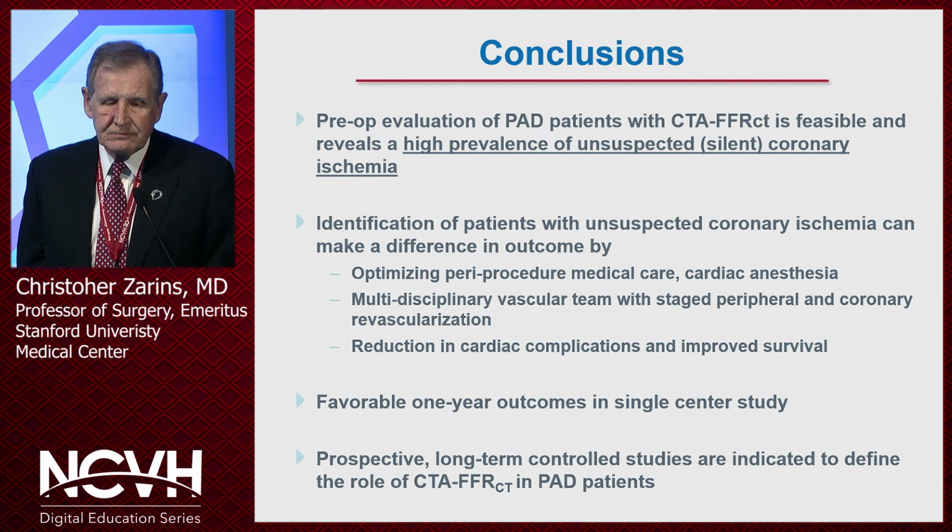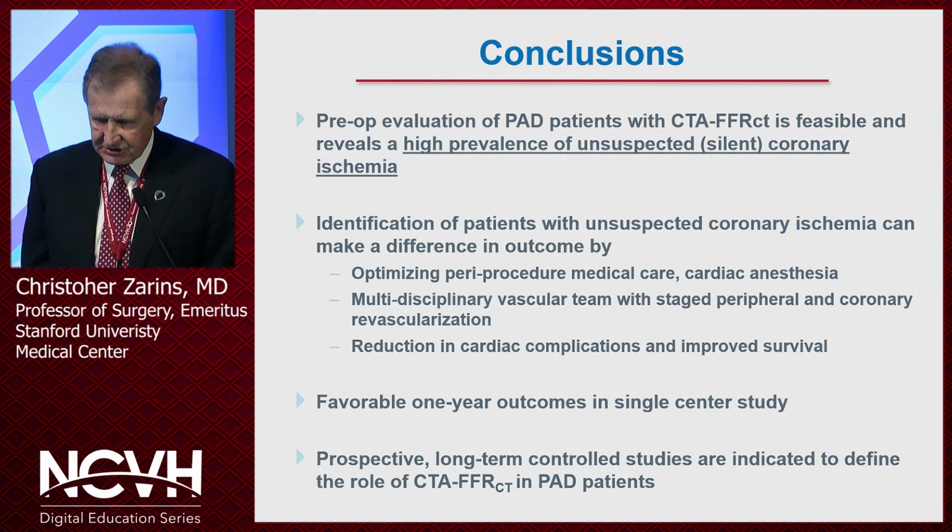So in conclusion, preoperative evaluation of PAD patients with coronary CT and FFR shows that there's a very high prevalence of unsuspected silent coronary ischemia. Identifying this ischemia, optimizing medical care, and doing staged peripheral and coronary revascularization can improve the long-term outcome of patients with peripheral arterial disease. Thank you.